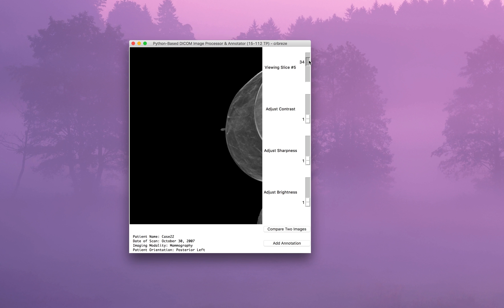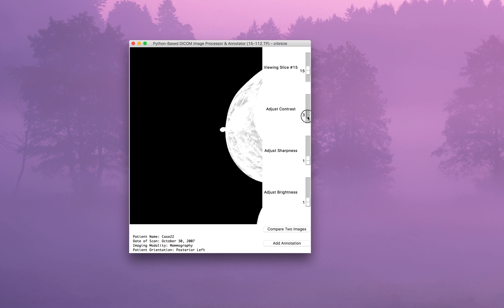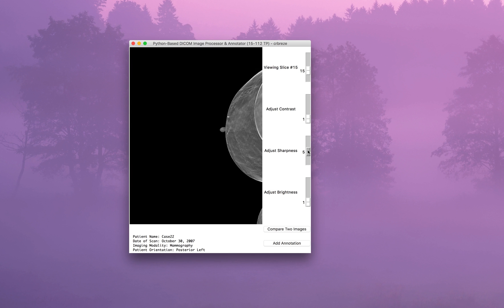You can move through the slices of the image to get a three-dimensional sense of what you're looking at, adjust the contrast, sharpness, and brightness, compare different slices between two different parts of the body, and add annotations if a physician were to use this tool to comment whenever they saw something abnormal or if there are any issues with the scan.